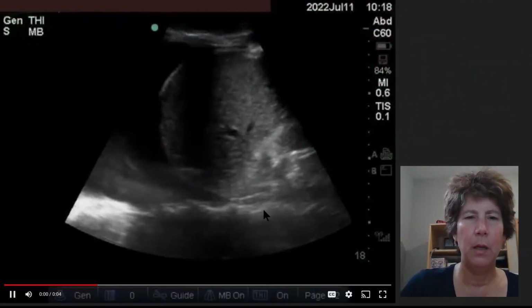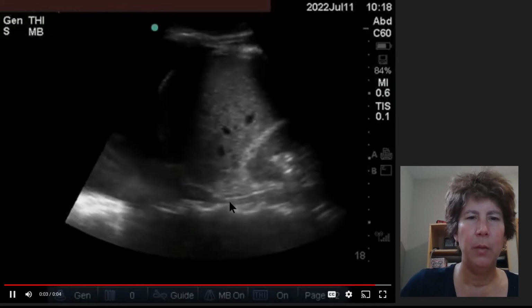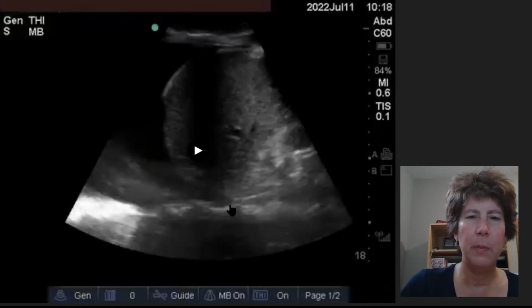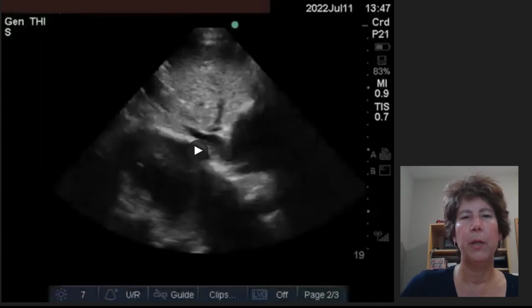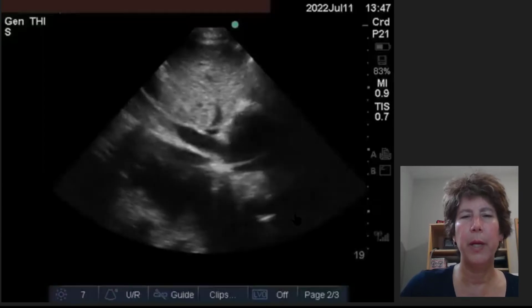That was the lung. So here we have the spine. Remember, you should only see spine up to the point where you have the diaphragm, because usually there's lung in this area, and because ultrasound doesn't penetrate air-filled tissue, you don't see the spine if there's normal lung between the probe and the spine. We only see spine here if there is atelectatic lung, consolidation, or effusion, and this is definitely quite a large pleural effusion.